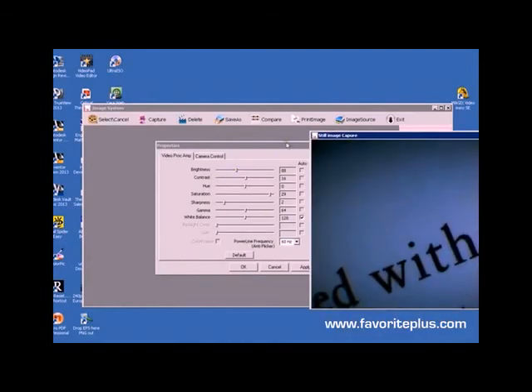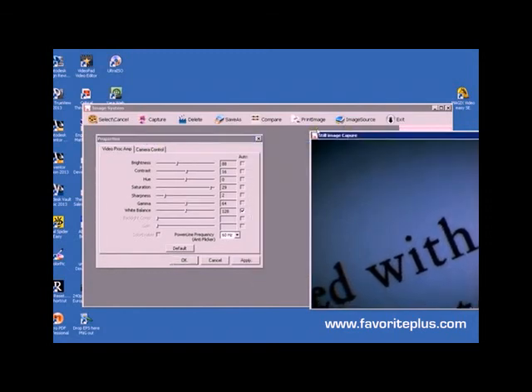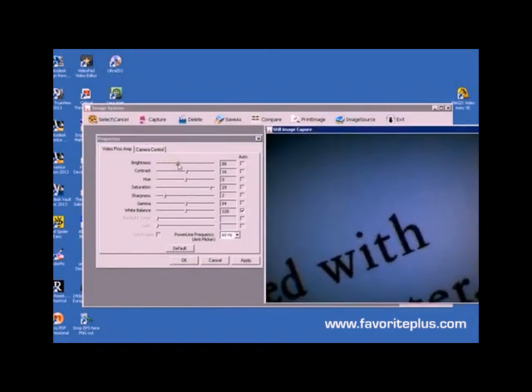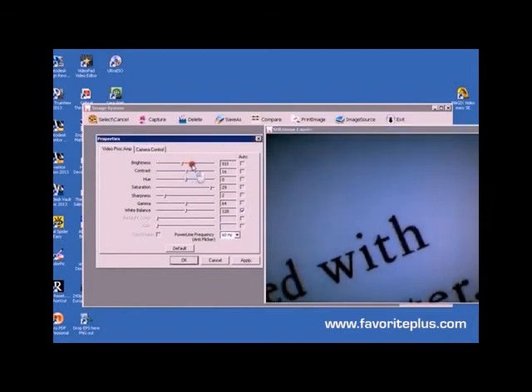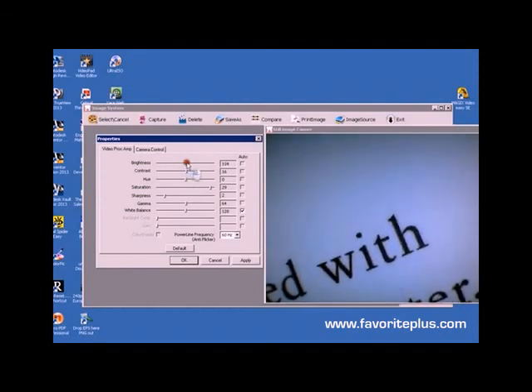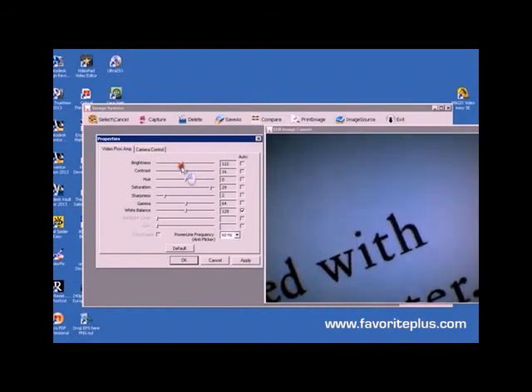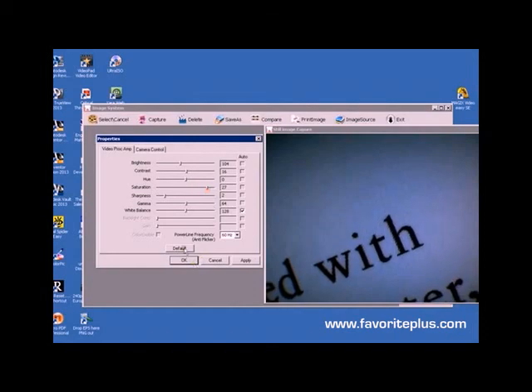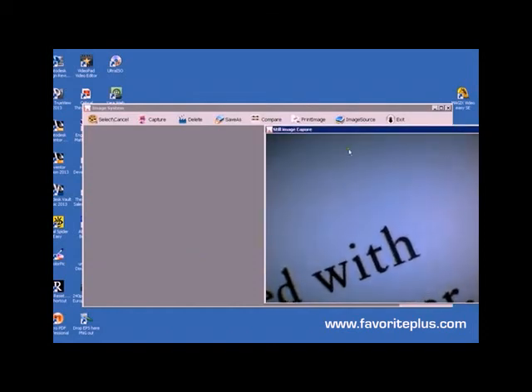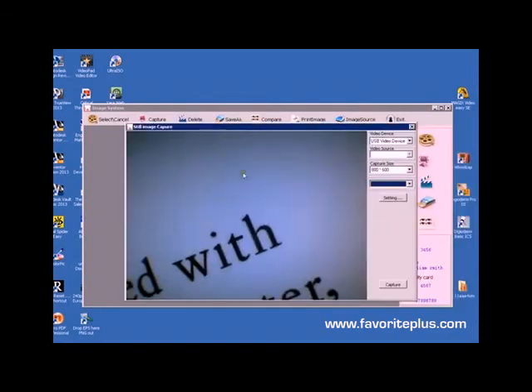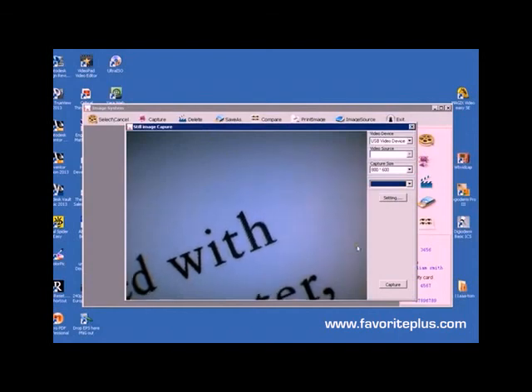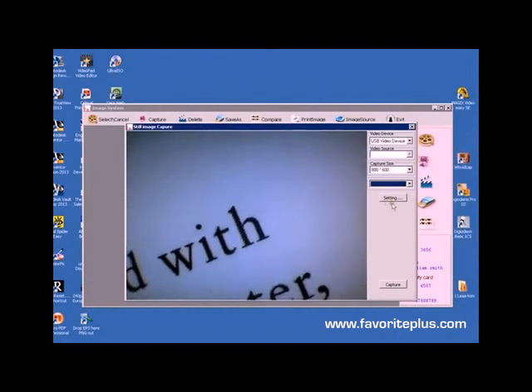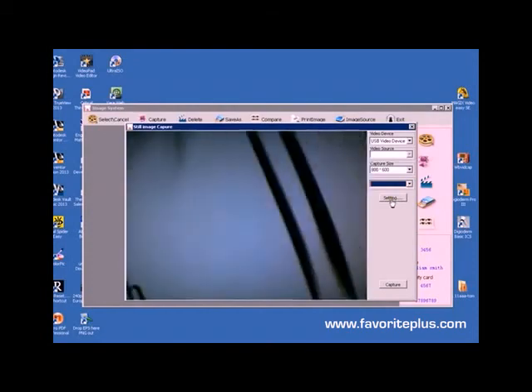Actually, I'm going to try and run the two of them together so you can see the effect of it. You can drop brightness down a bit, so every computer is different, so you need to do color calibration for your particular computer. You can increase saturation. I'm just going to go to default again. So remember to go and set your color settings and calibration settings by just clicking on the setting button.